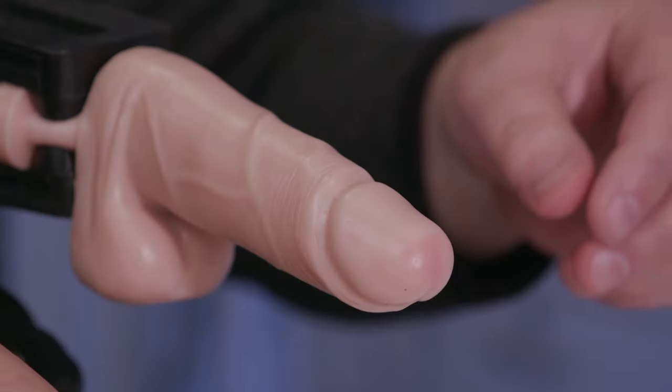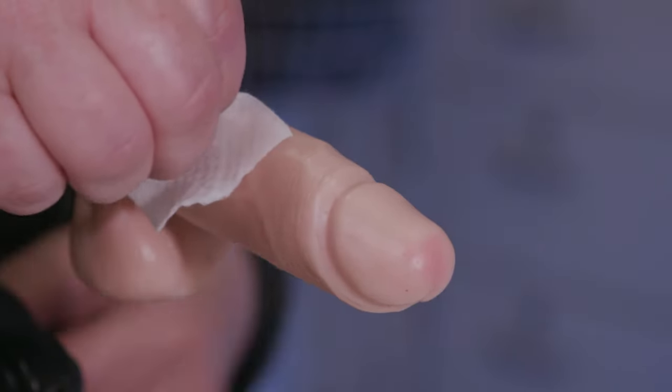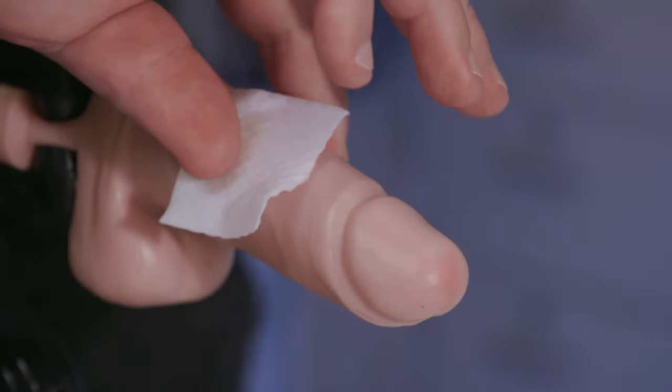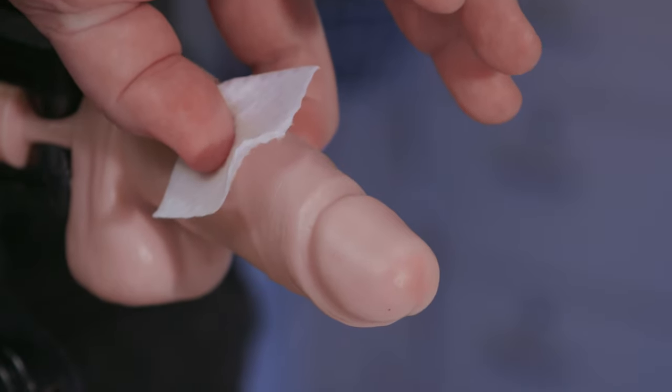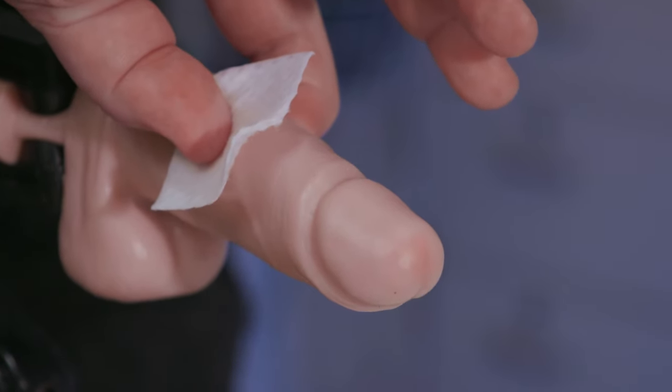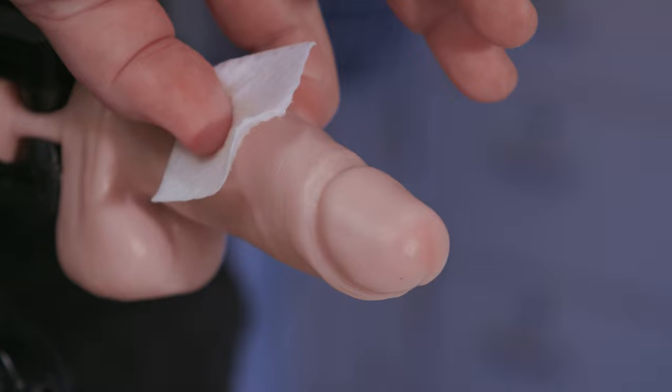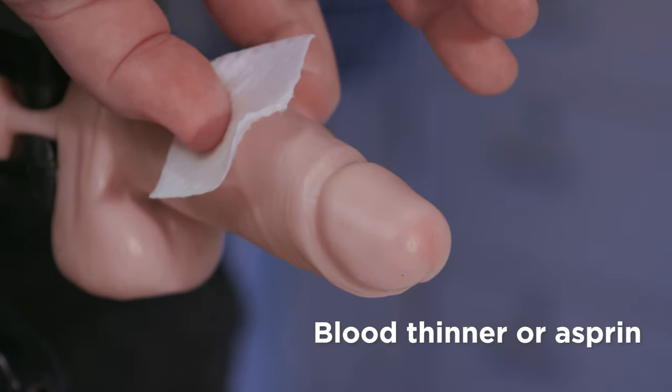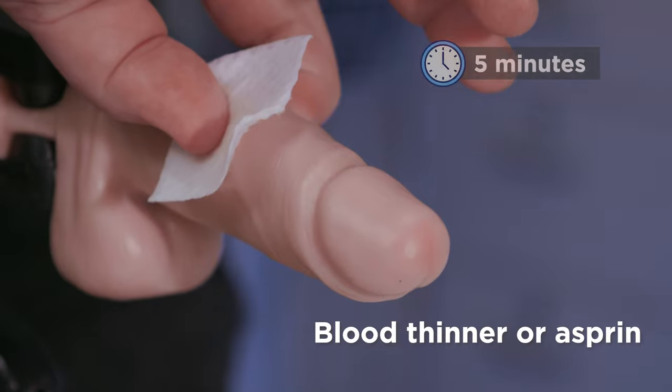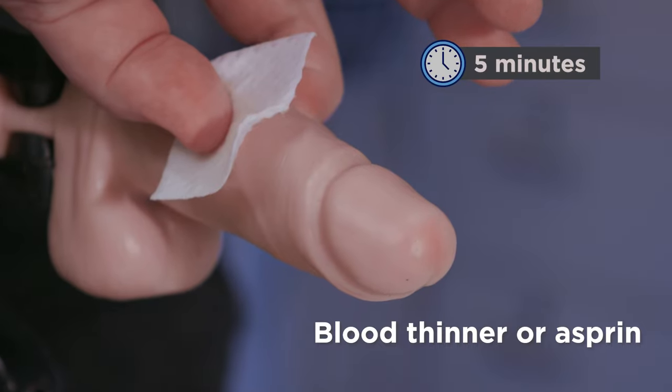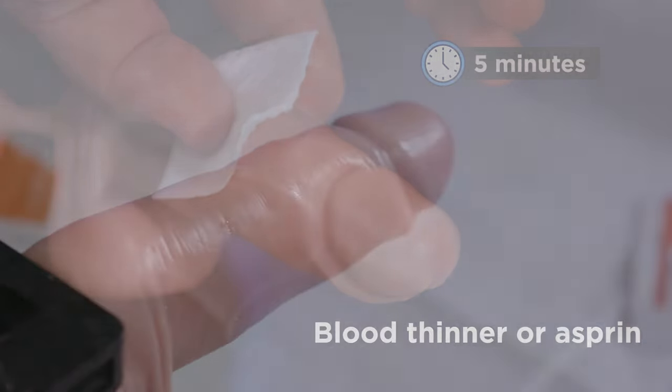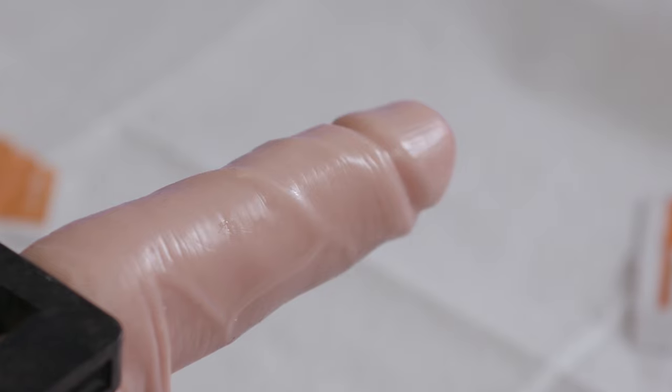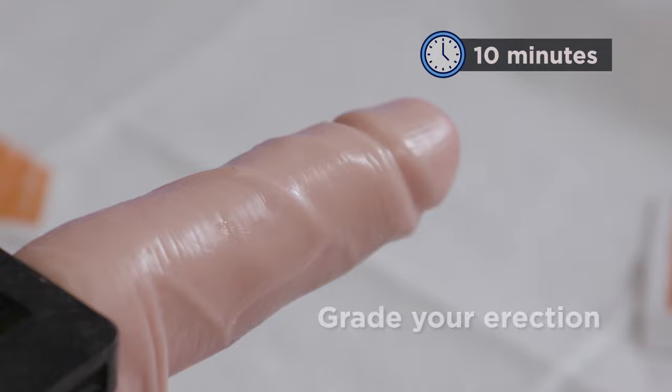Pick up the alcohol wipe and place it over the injection site. Hold it in place with your thumb and place your index finger on the opposite side of your penis. Apply pressure for 2 to 3 minutes. If you're taking a blood thinner or aspirin, apply pressure for 5 minutes. This will help decrease any bleeding or bruising. Then, stimulate yourself so you get an erection. After about 10 minutes, grade your erection.